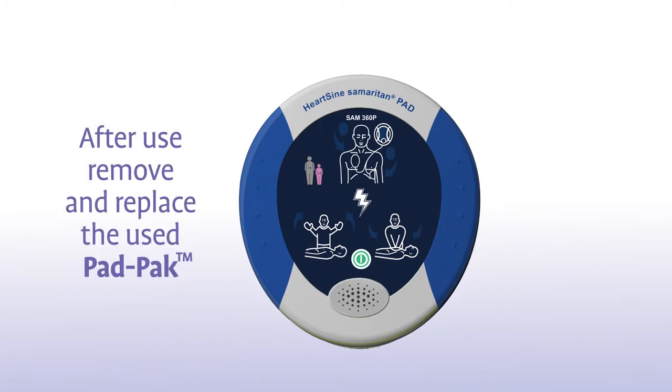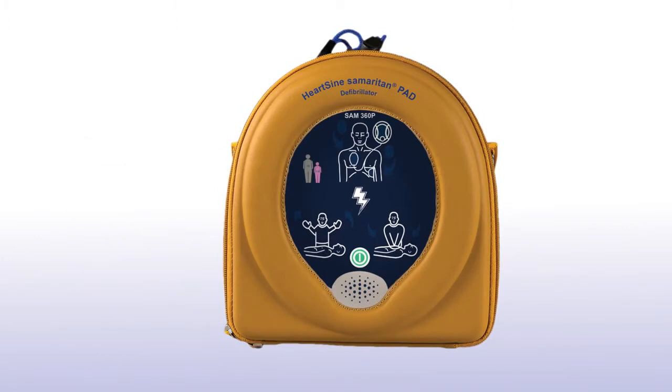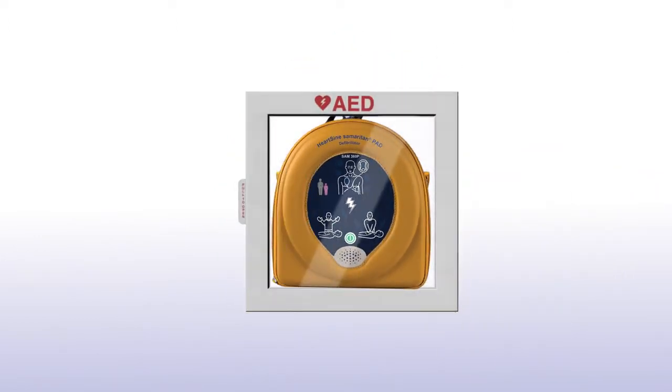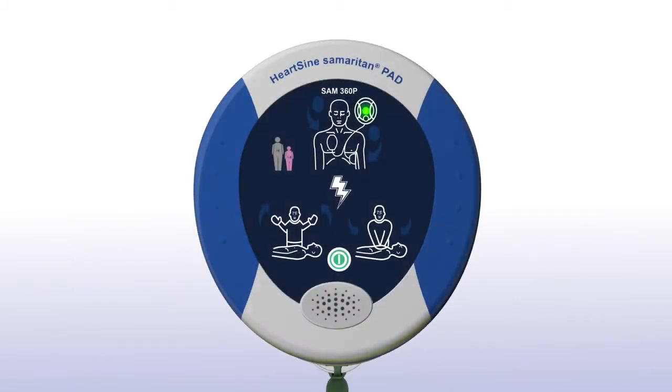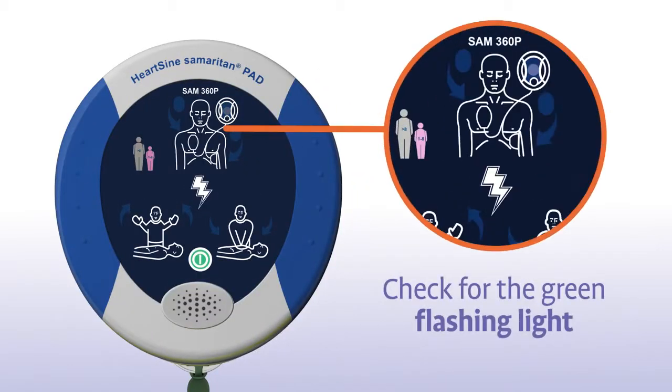After using the Samaritan PAD, slide a new PAD pack into the unit and store it as usual. Remember to follow your local battery disposal guidelines. Once a week, check that the green light is flashing so you know the unit is ready in case of an emergency.